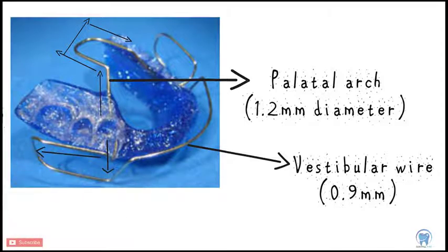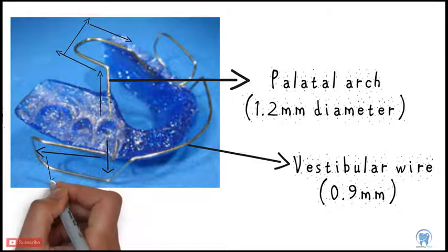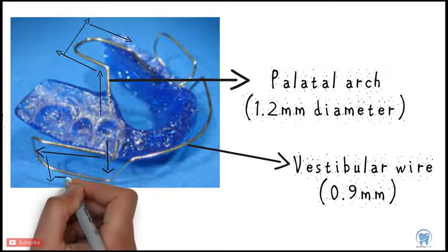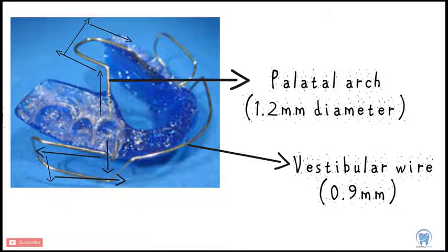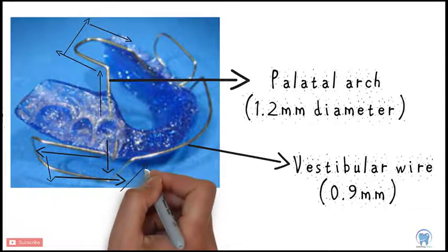Measure to the molar, a rounded bend is made so that the wire runs at the level of the lower papilla up to the mandibular canine, where it is bent to reach the upper canines. It forms a mirror image on the other side. The vestibular wire is kept away from the surface of the incisors by the thickness of a sheet of paper. The lateral portions of the wire are sufficiently away from the teeth to allow expansion of the arch.